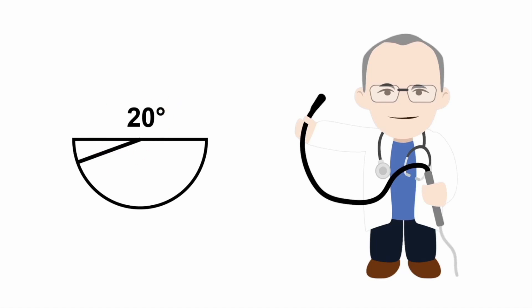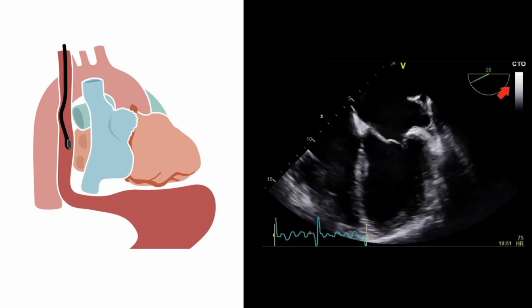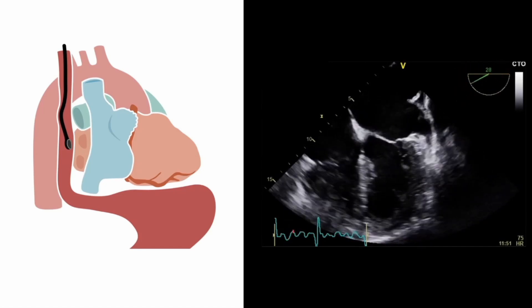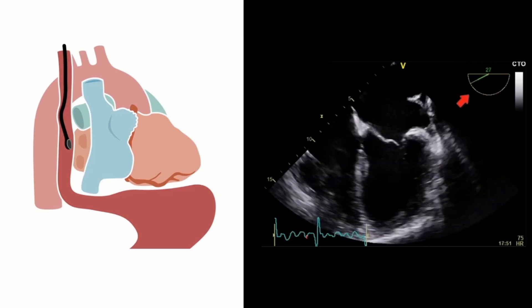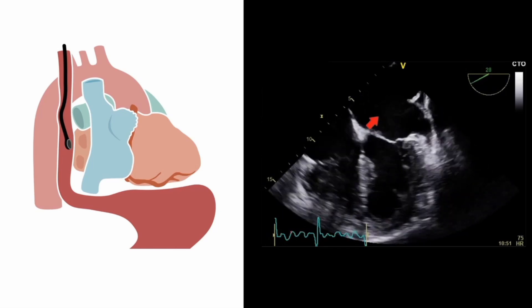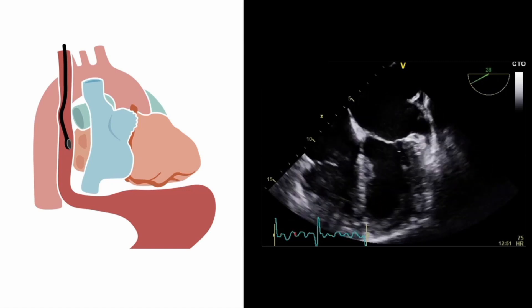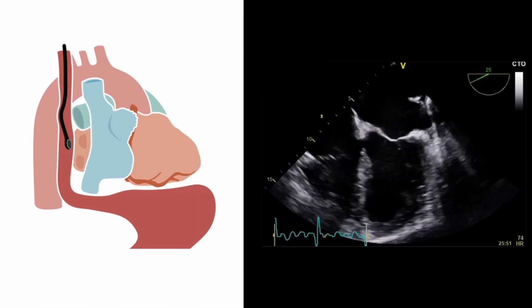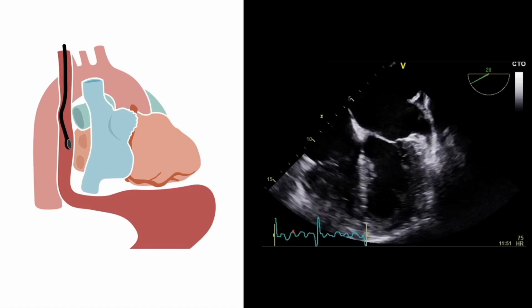The exact amount will vary from one patient to the next, but by increasing the angle by about 10 to 20 degrees, we will start to fully optimise the four-chamber view. You can see at the top right-hand corner of the image that we're changing the angle of the transducer imaging plane. As we alter the angle by a few degrees, you can see how the aortic root and left ventricular outflow tract disappears from the image, allowing us to obtain a true four-chamber view.